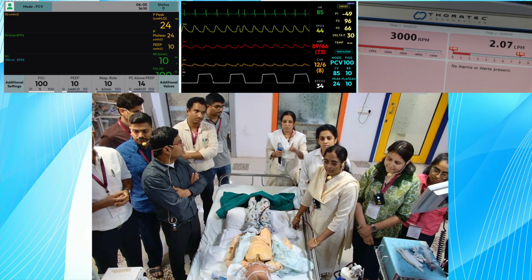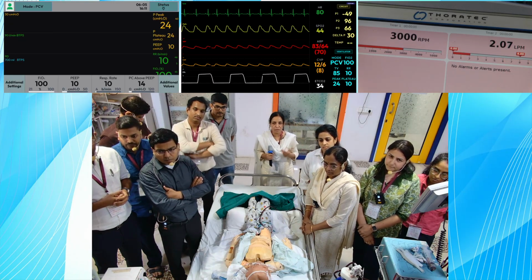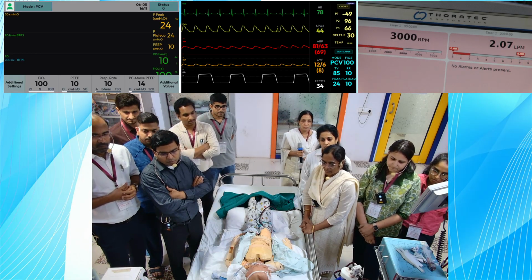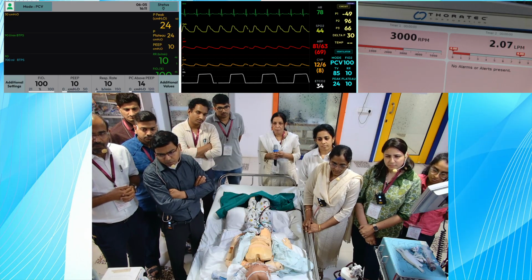The prime concern is both the cannulas have the same dark color. Yes, so that is your concern. So that is something wrong with the machine. Yes, sir. So can you focus more on the machine? Yes. In the machine, which component are you looking at? Oxygenator, sir. You are looking at the oxygenator and blender. Okay.